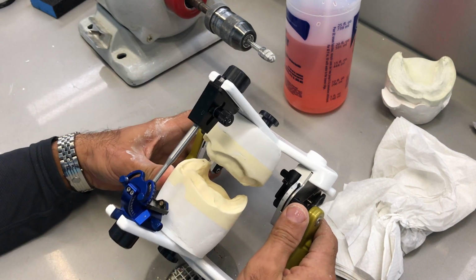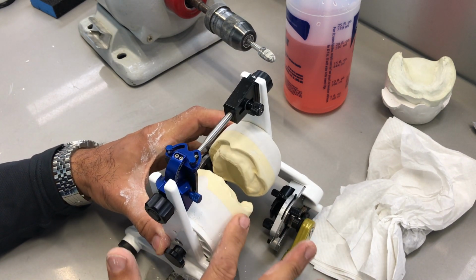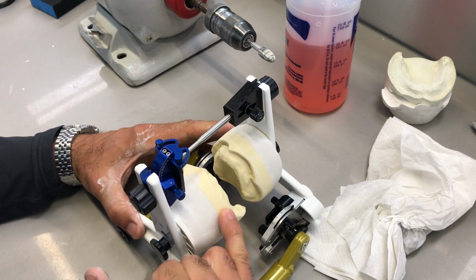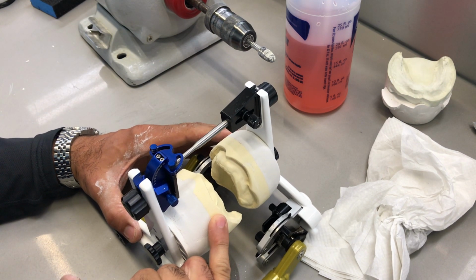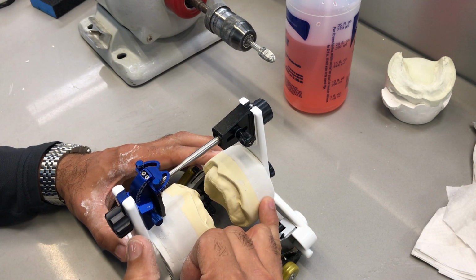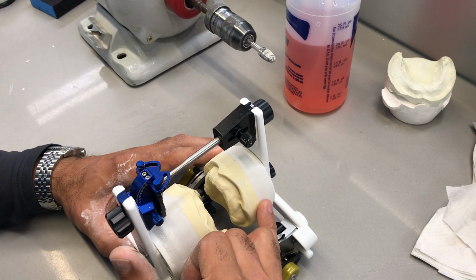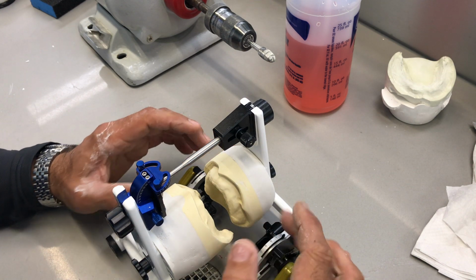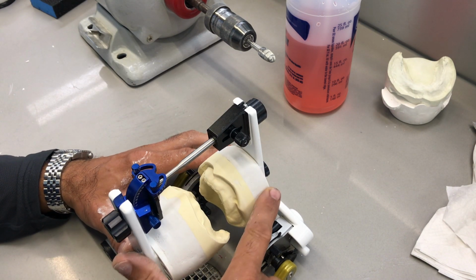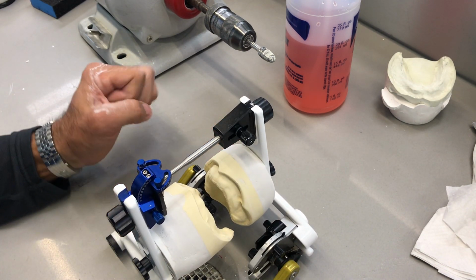And we should have this result right here. We have something that looks very much parallel between top and bottom. The sides of the model, as well as the sides of the mounting, are very smooth to the touch. And I can easily assess how things come back together. And as you saw here, even though this separated, I was able to attach it back together, but you can't tell because it's perfectly back in the same position because of the keyways and the fact that the separator is holding it together, and I have a nice flush finish between the mounting and the model to enable me to assess that. Okay, so on the next step, we're going to be simulating the bite registration on this case.